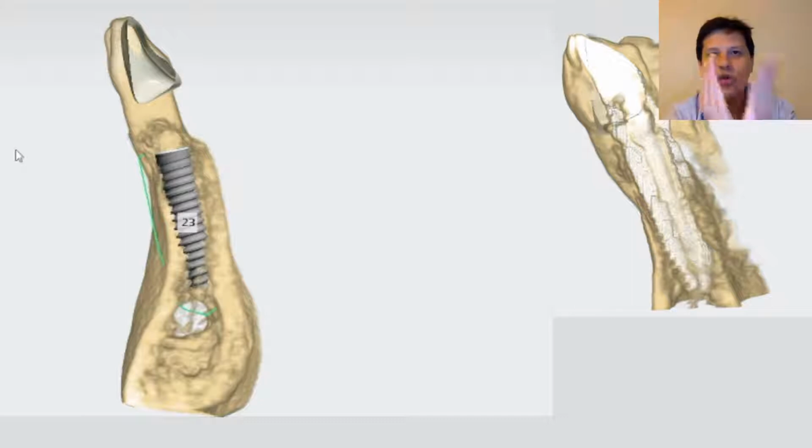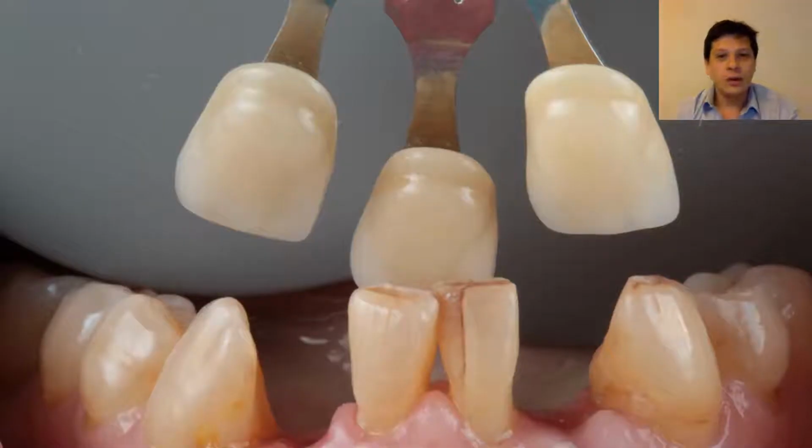So for me, there's no better example of how digital technology will come to help you than the lateral incisors. I mean, you can look left and right. You can see implant position left and right. Question: would you be able to do this freehand? Sure, but how many failures did you see in your clinic with freehand in these lower lateral incisors? Huge amount. You become better because you decrease the error, and by decreasing the error, the patient becomes happy, socially happy, and you're better off.